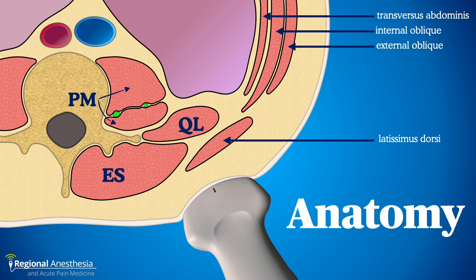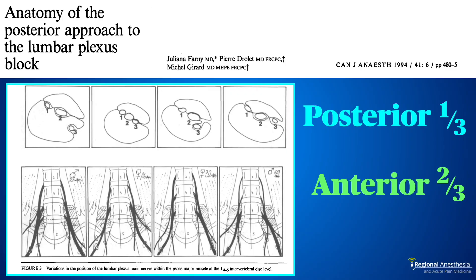Here's a cross-sectional view of the lumbar paraspinal area. We see the erector spinae and quadratus lumborum muscles. The psoas muscle is located anterior to the transverse process and tucked in tight to the vertebral body. You can appreciate a fascial plane that runs through the psoas about two-thirds of the way back — this plane is a channel in which the lumbar plexus travels. The plexus is found at the junction of the anterior two-thirds and posterior one-third of the psoas muscle.